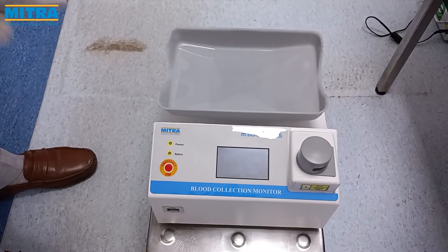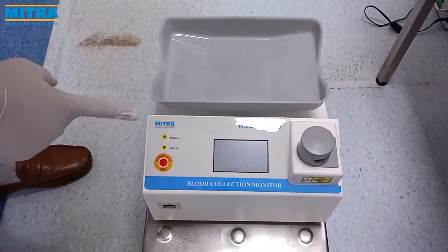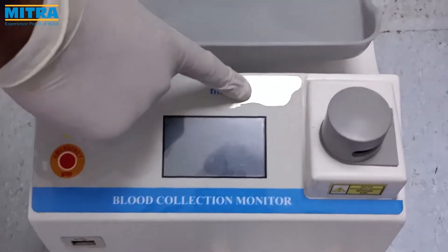Welcome to Mitra Industries. Today we are going to introduce you to the Mitra MBCM Mini and show you how to use it.